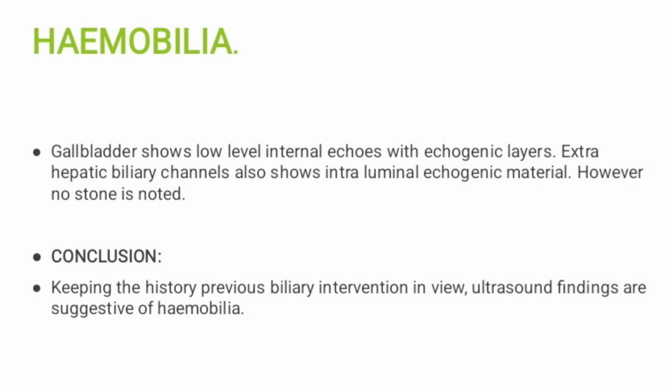Therefore, you have to take the history of the patient and then look at the images and then document it on the report. So this was the classical report of the hemobilia.